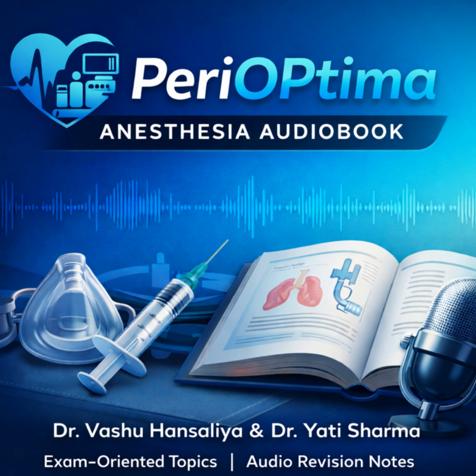That's right. And this brings us directly to their non-negotiable importance in the difficult airway algorithm, the DAA. The laryngeal mask airway, the LMA, as the archetype, is a pivotal, mandatory component of the American Society of Anesthesiologists, the ASA's difficult airway algorithm. And this is where that life-saving potential really comes into play. They function as a critical life-saving temporizing measure in that scenario every single anesthetist dreads. The CICO. The cannot intubate, cannot ventilate scenario.